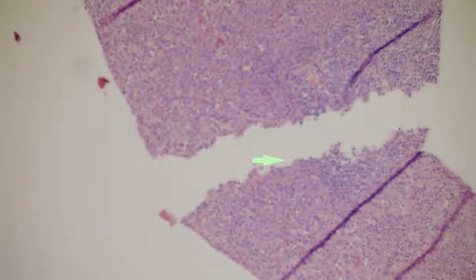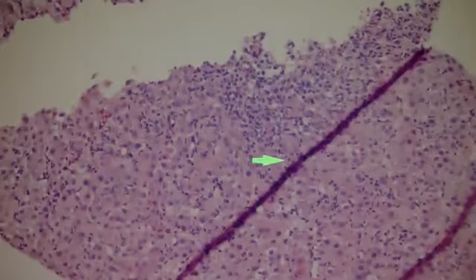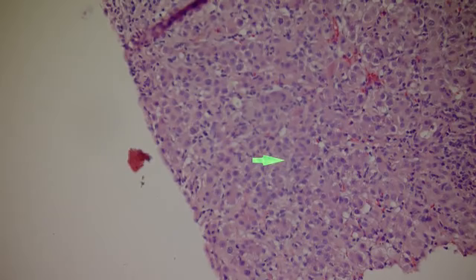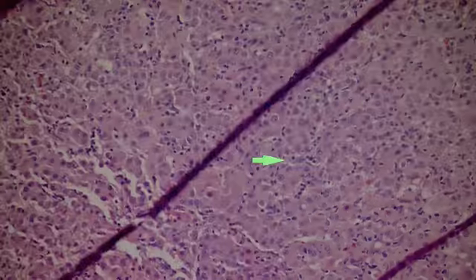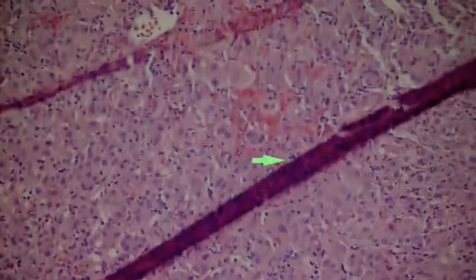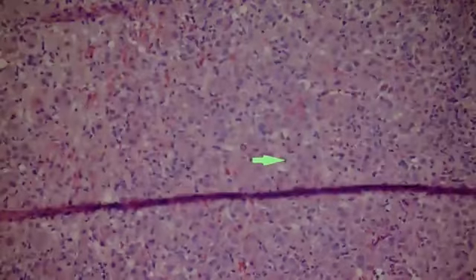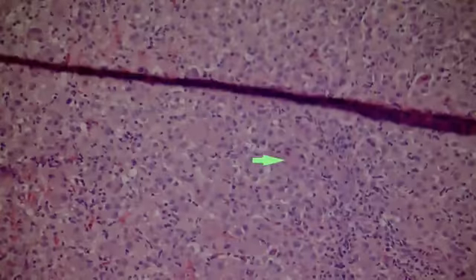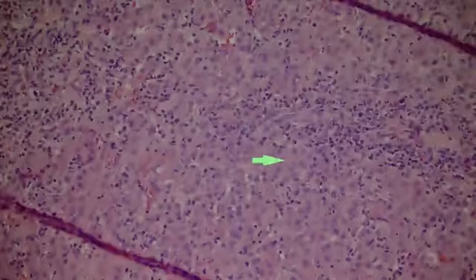And as you look at this case, what's the pattern here? Same, right? So acute hepatitis, although this one has a little bit more activity in the portal area. As you look around, it's in the sinusoids, there's some Kupffer cell hyperplasia, and there's dead hepatocytes, a little bit of fat, but that's not the main feature here. So another case of acute hepatitis, you start to look at the inflammation. Does it help you? Kind of mixed. I see a few EOs, maybe a few plasma cells.